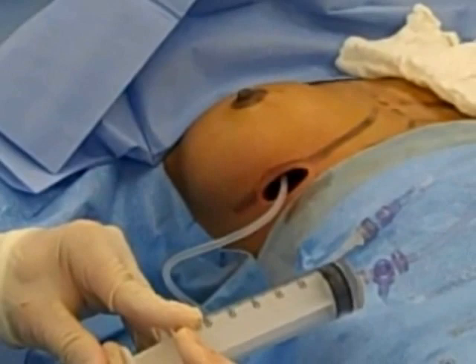So we can change the volume a little bit. This is a saline implant — that's all there is to it.